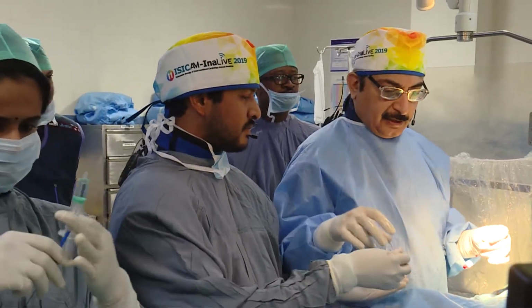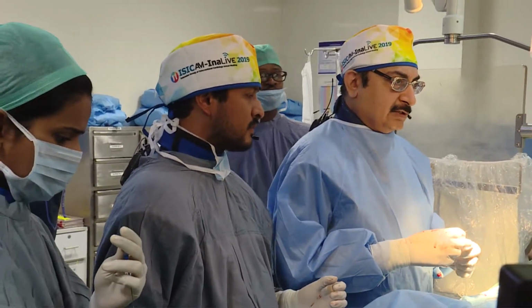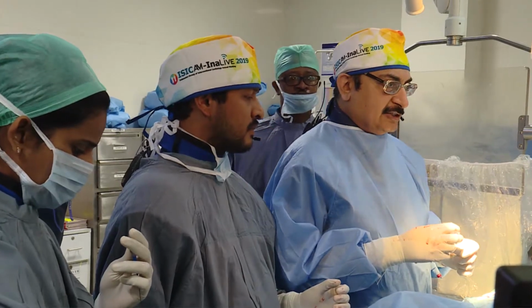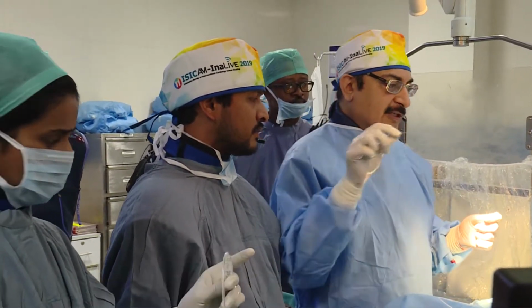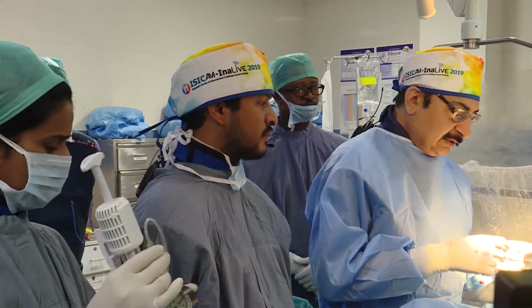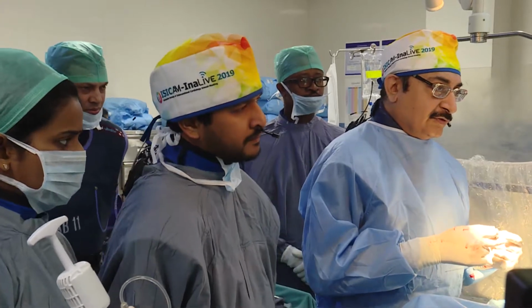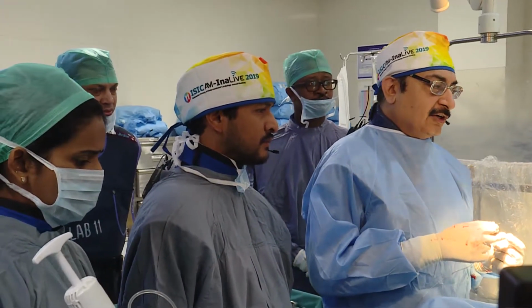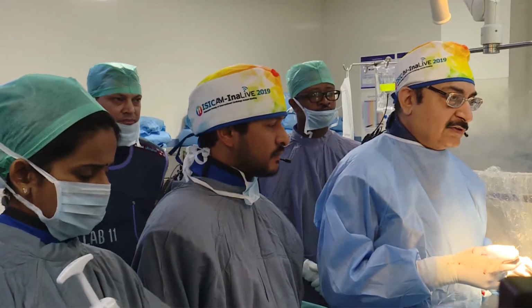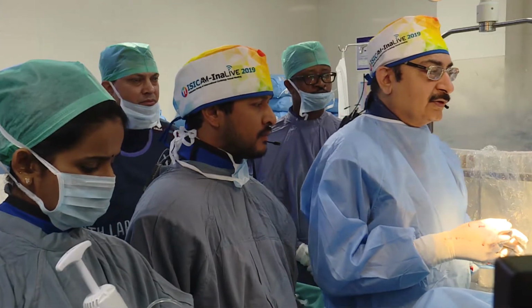My technique here would be to first dilate with the balloon and then do a cutting balloon, and then see if I can get a good result. I may just do a drug-coated balloon and assess the result. If the result is good, we may just stop there.